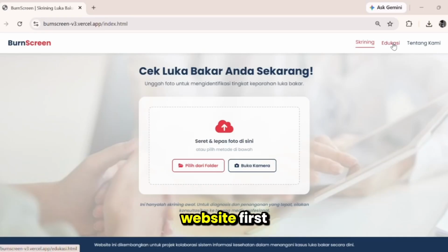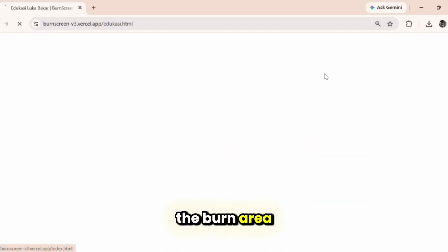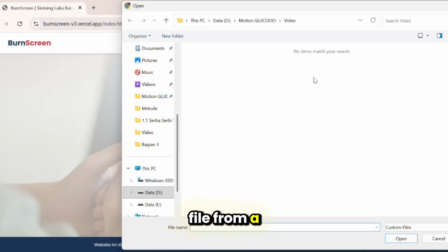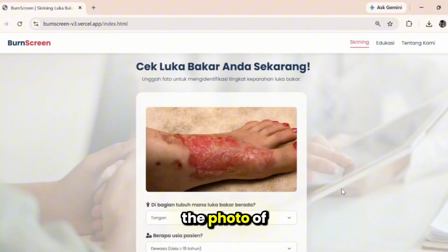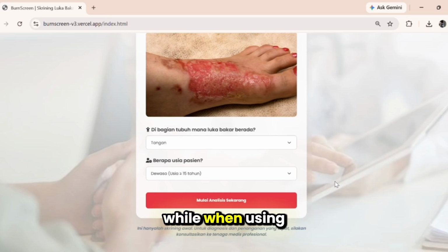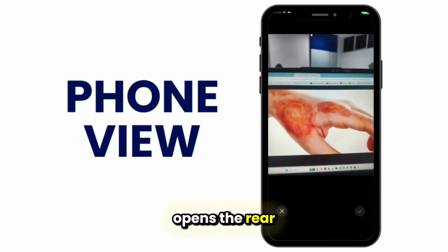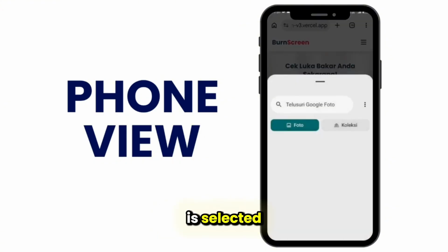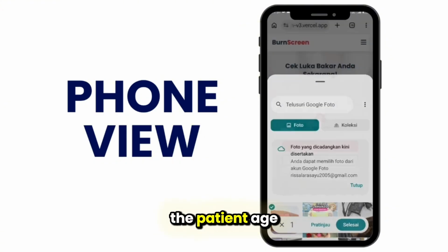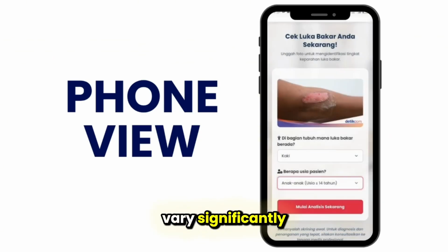Let's try the website first. The homepage greets us with a modern clean UI. We can drag a photo of the burn here or select a file from a folder. If using a laptop, you can upload the photo of the burn area, while when using a smartphone, the website automatically opens the rear camera and uploads from your gallery. Once the image is selected, we enter the burn location and the patient age. This data is crucial because treatment can vary significantly.